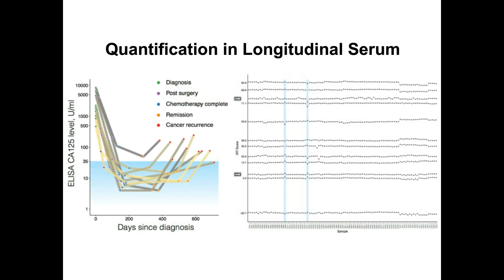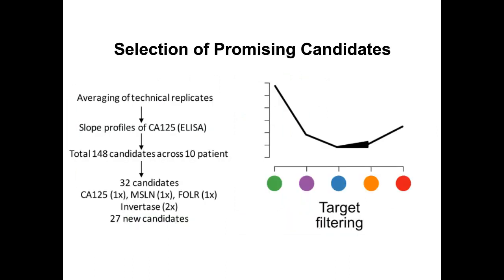At the very end here, you can see we had an LC failure and a column failure. That's where these slight bumps happen, and one has to reschedule these assays then. And these two samples indicated in blue did not behave well. We had spray issues, and they had to be removed. So it's about a 2% failure rate over 100 runs, which I think is reasonable. And then we quantified our 451 targets over these 100 samples.